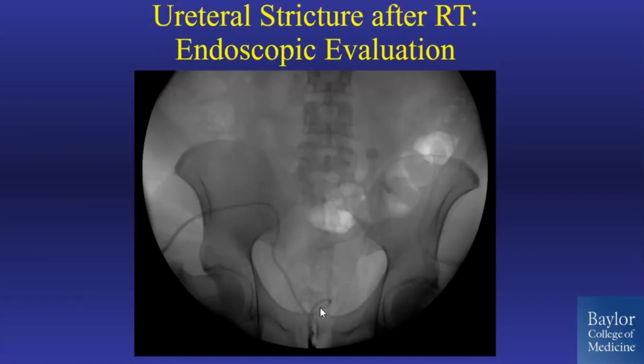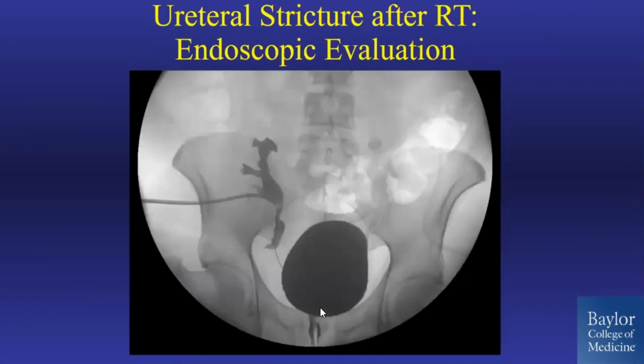That gives me great flexibility as to whether I want to put a ureteroscope anterograde or retrograde, or whether I want to use a laser or balloon. It really gives me good access and options. I mainly want to leave the operating room having a full understanding of any reconstructive options that I would need to do in the future.